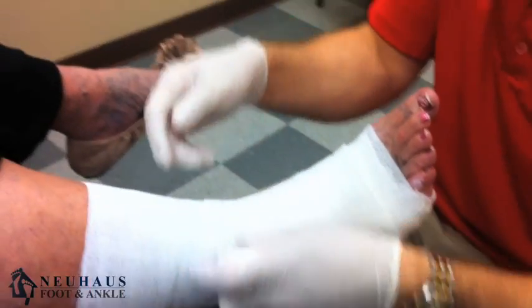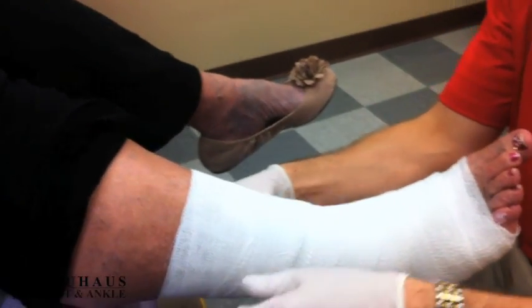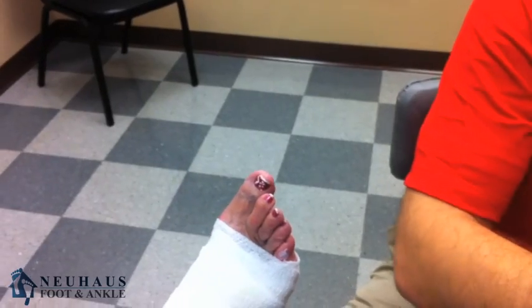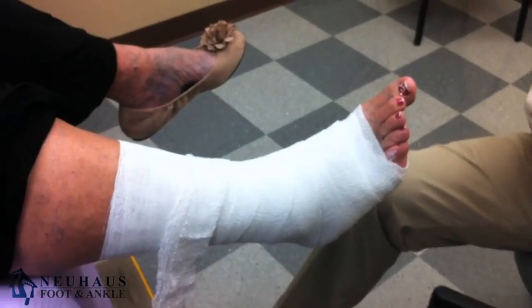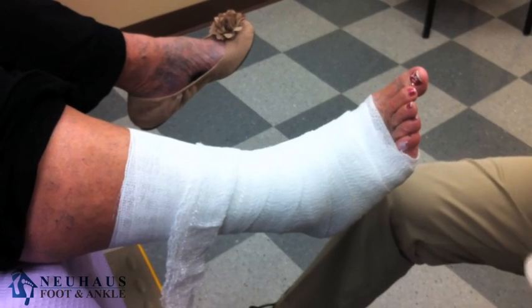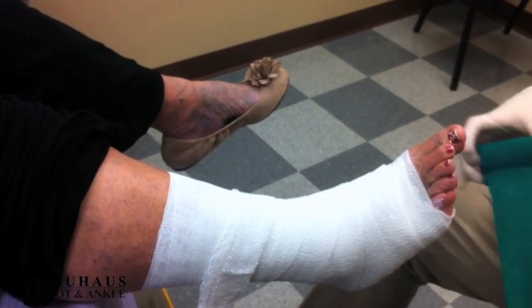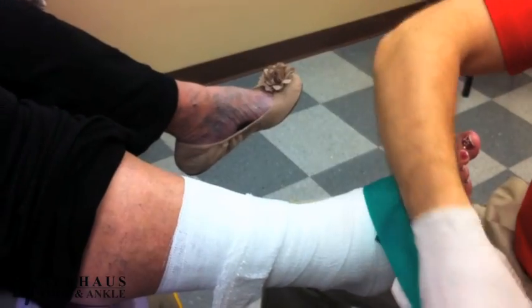The biggest thing is it controls the swelling. After we put the wrap on, this patient will be instructed to wear a surgical shoe and just limit her activity, but she can go ahead and do whatever she wants. The downside is you do have to keep it dry — you've got to cover this with a bag of some sort if you're going to bathe. If you get it wet, you cannot take it off and put it back on like you could an ace wrap.